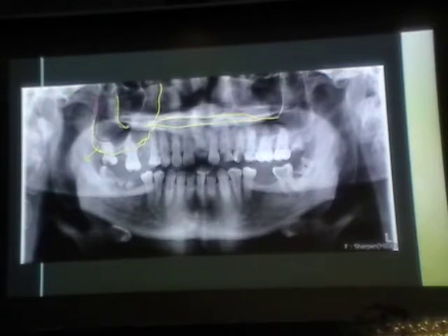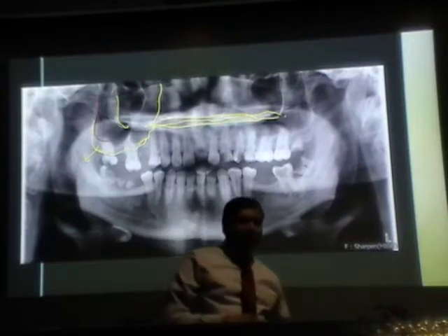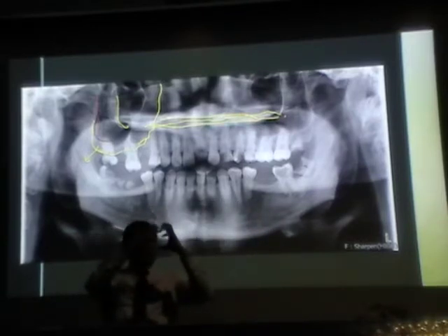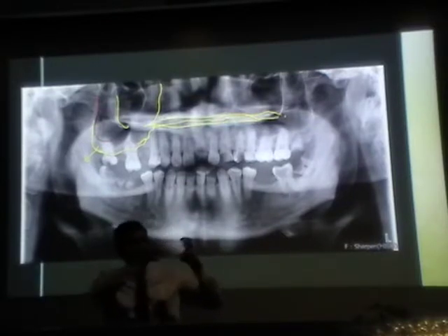Let's see. So this bottommost line is the hard palate. The top one on that is the ghost image of the hard palate. Remember, ghost images will be higher up, on the opposite side, and they will be horizontally magnified. As if you stretch something.